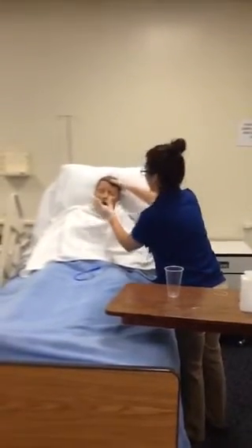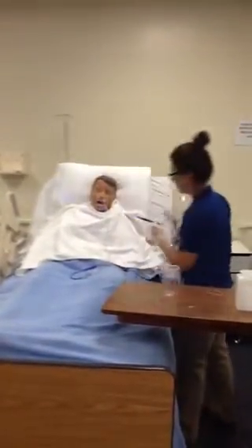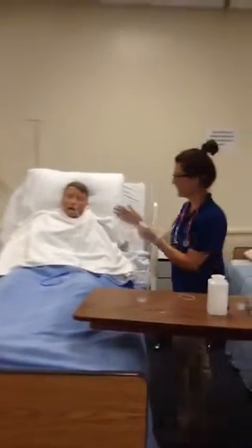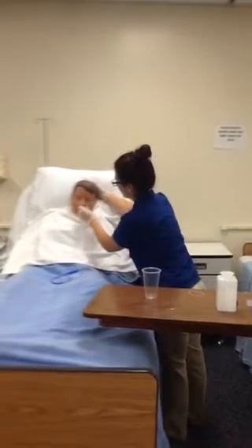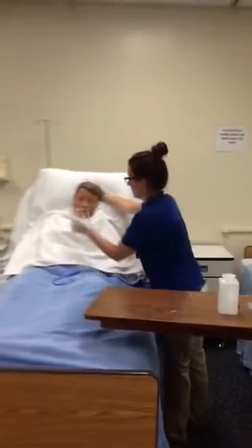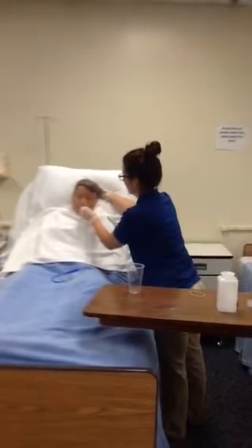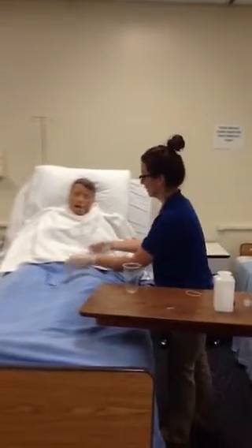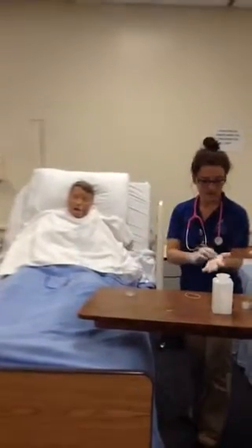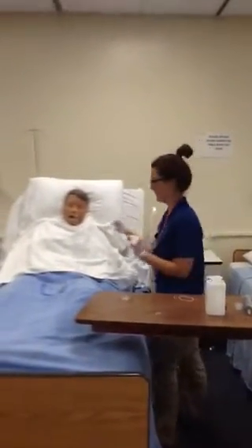Okay. So I will check the back of the oral cavity for any coiling. Okay. I don't see any coiling, so I will continue advancing with Mr. Wilson placing his chin to his chest and having a sip of water and swallow, swallow, swallow. All right, so I am going to temporarily tape the tube to his cheek so I can verify placement.